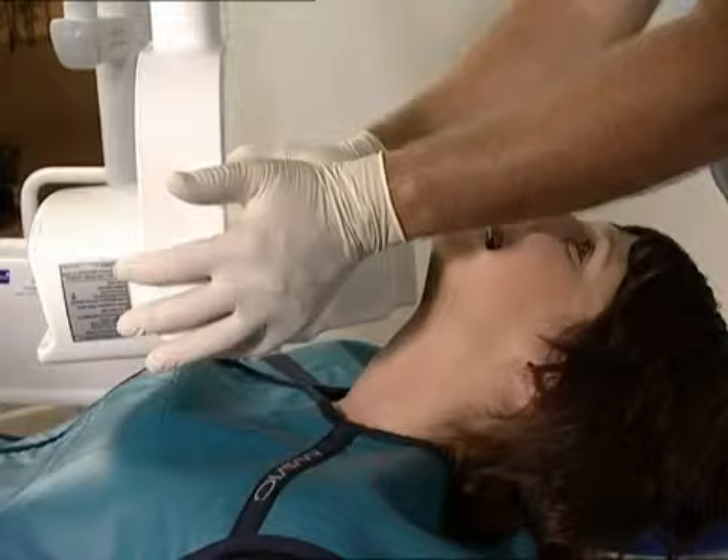Diagnostics in change. Use the advantages of digital x-ray diagnostics with Dura image plate technology and the Dura Vista Scan Perio.